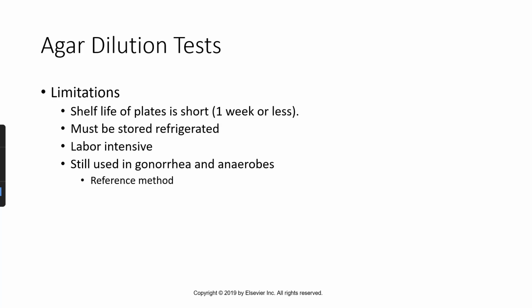The limitations: there's a short shelf life. Once you create those plates, and it's really time consuming to create the plates, they only last for a week. They must be stored in the refrigerator. It is labor intensive, but it's still used in gonorrhea and anaerobes as the reference method.